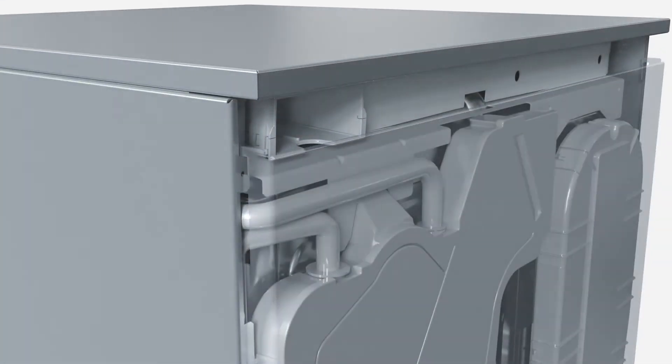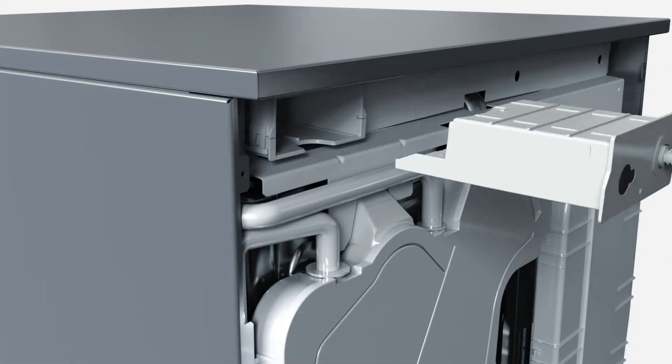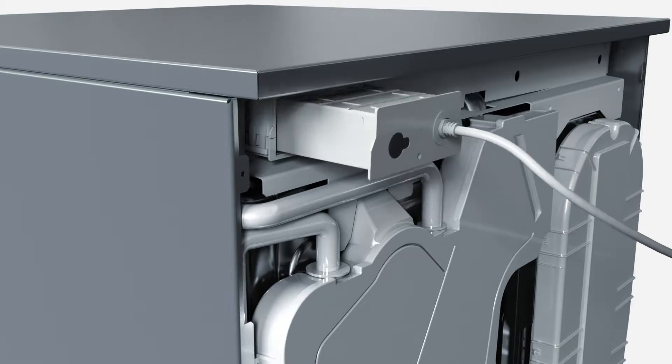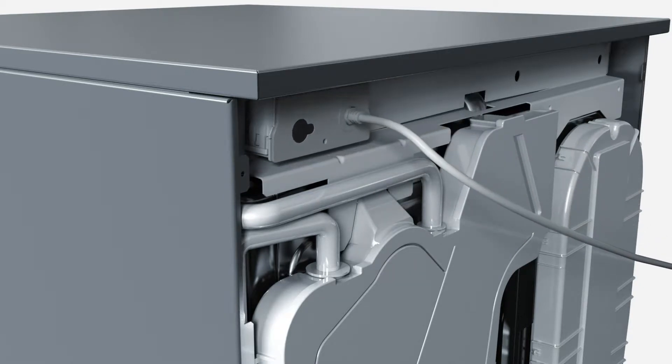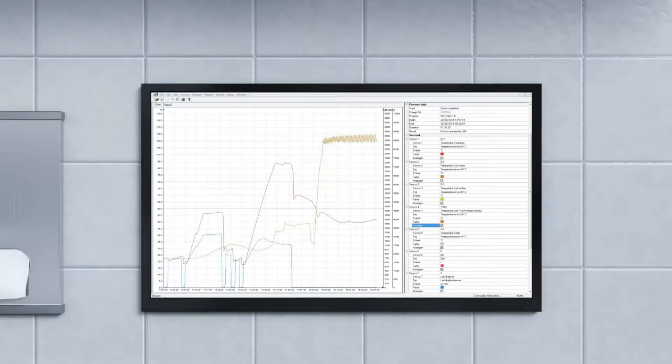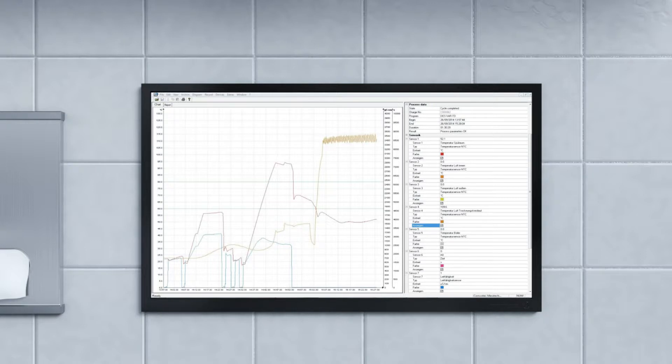With the aid of the Ethernet module, the machine can also be conveniently connected to process documentation systems. Automatic network parameter selection and the use of common IT standards guarantee ease of operation.